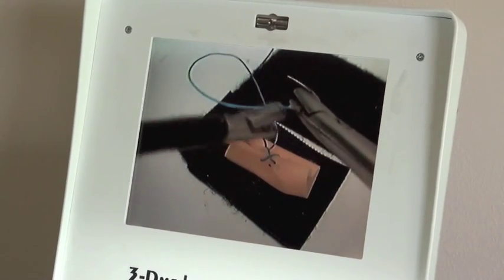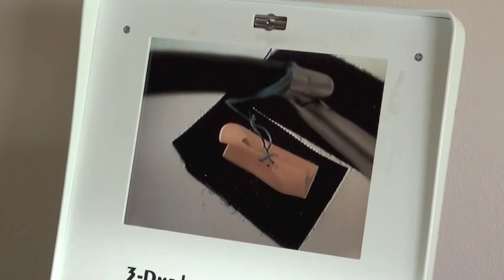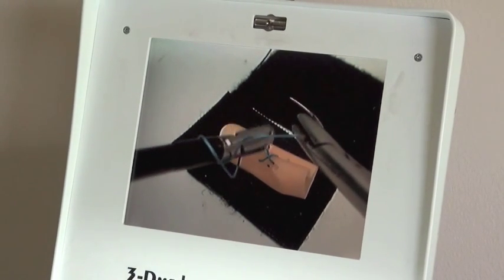Again, it's nice and parallel. And I can change this parallel line. I'm going to wrap. I'm going to grab my tail.